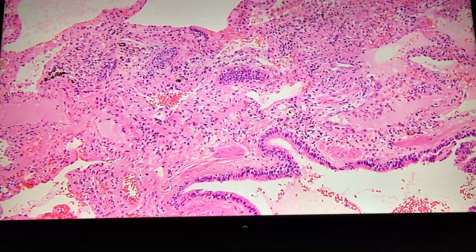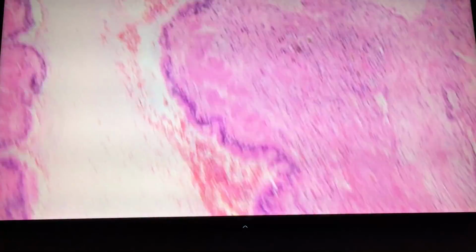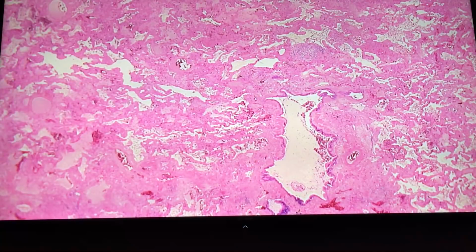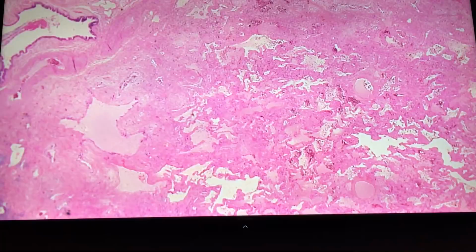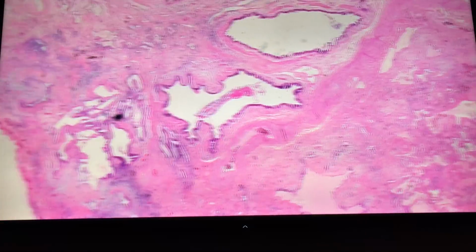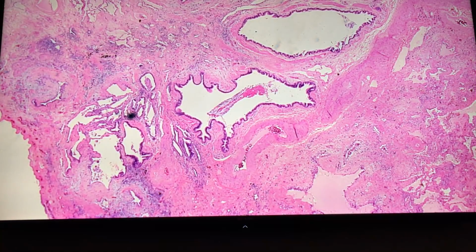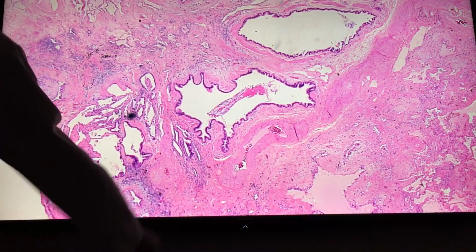Do we have any areas kind of like an ill-formed granuloma maybe there? But so go back again, Aaron, to low mag. Do we have honeycomb change anywhere? Let's see, yeah. So exactly, you want to see at low magnification what is really going on in terms of the pattern distribution. So you see there is actually, stop here Aaron, for a second. This is actually scarred lung. It is scarred, meaning that the architecture is all distorted. Yeah, and just get it into focus.